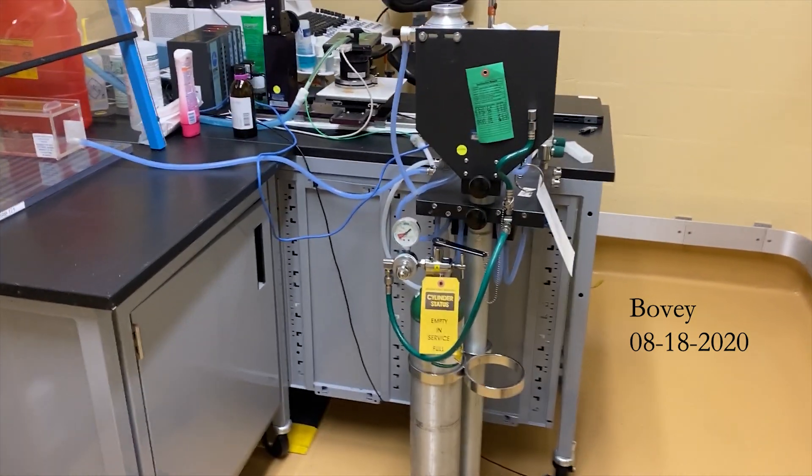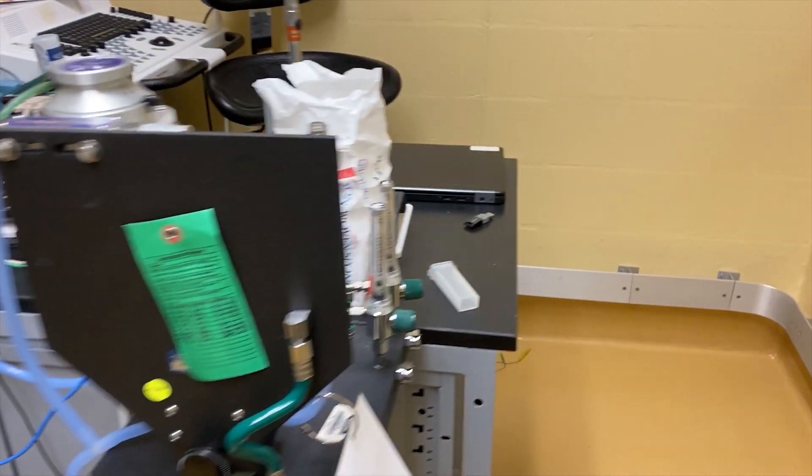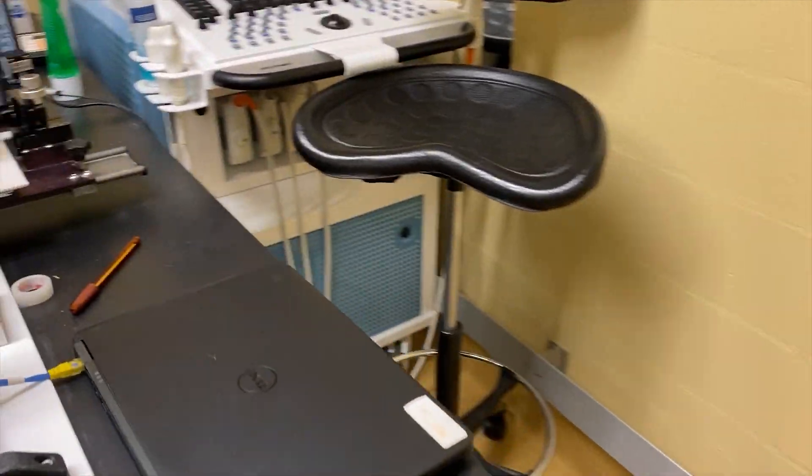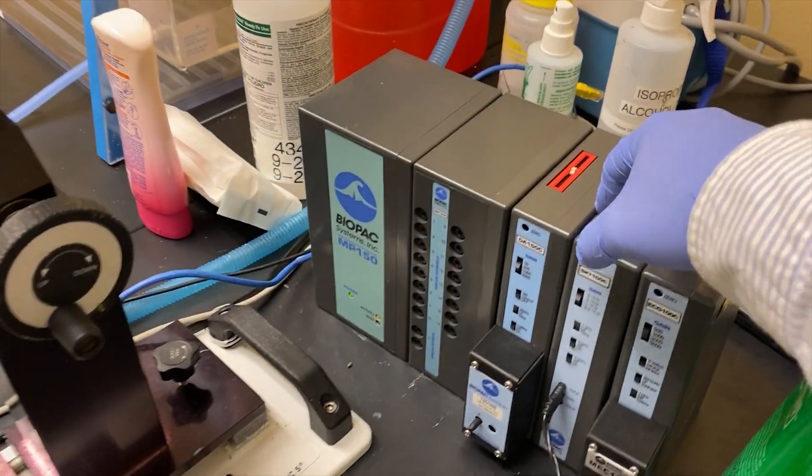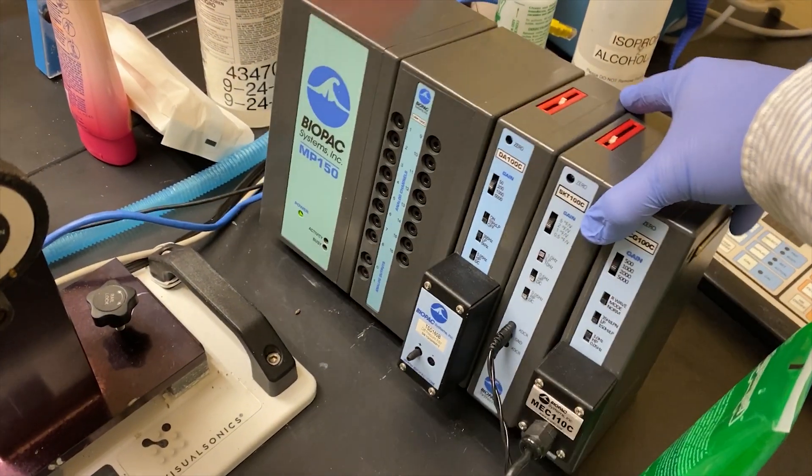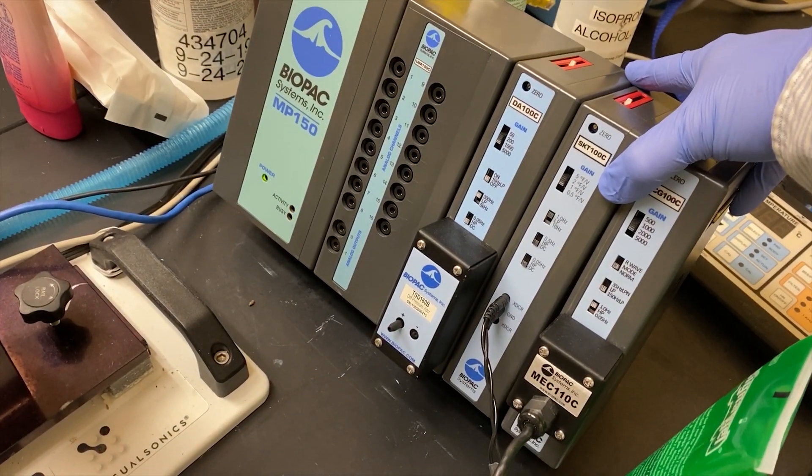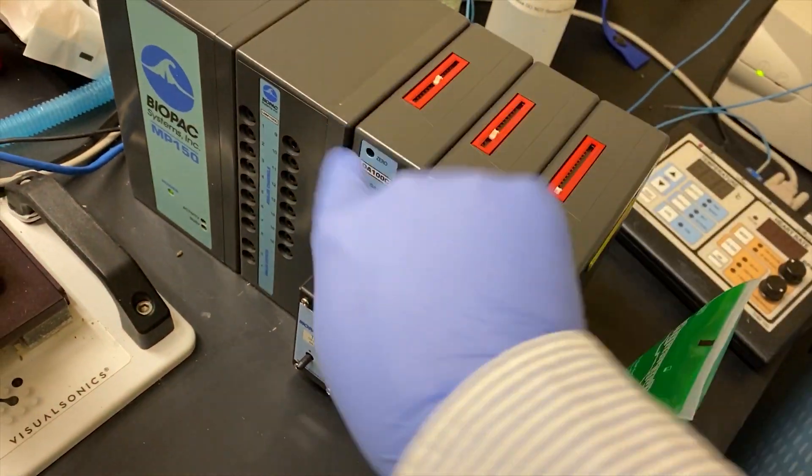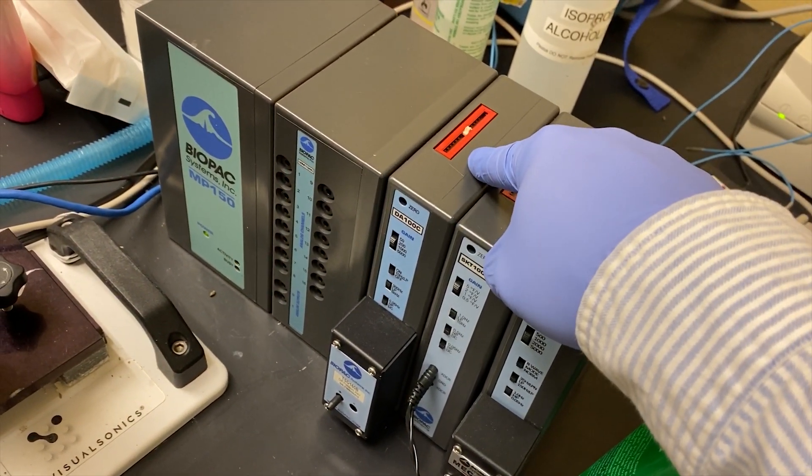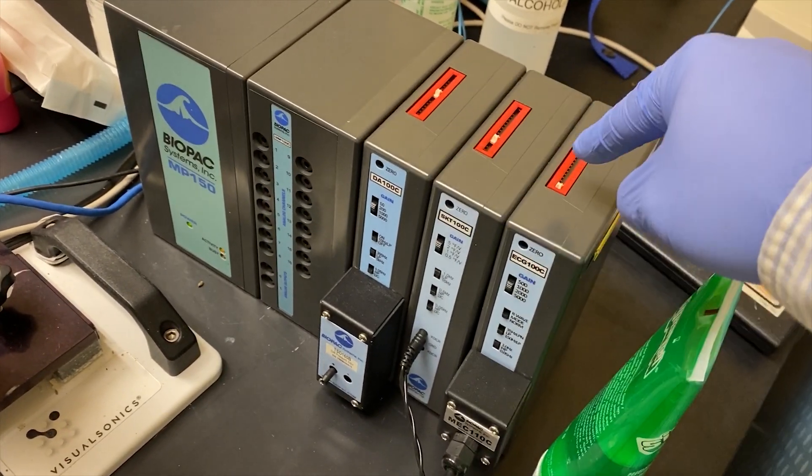Hi, today I want to make a video on how to record the ECG. First you will get this device and there are so many parameters in front and in the app but you don't need to change anything.